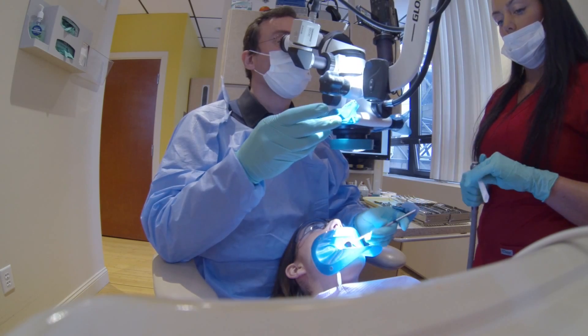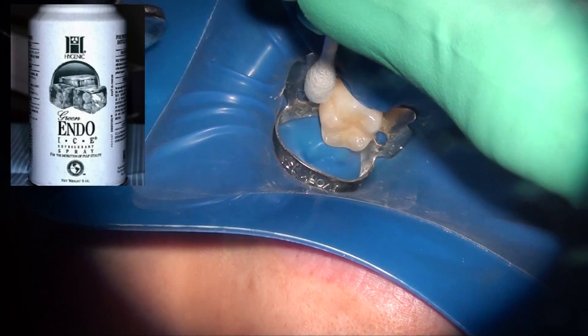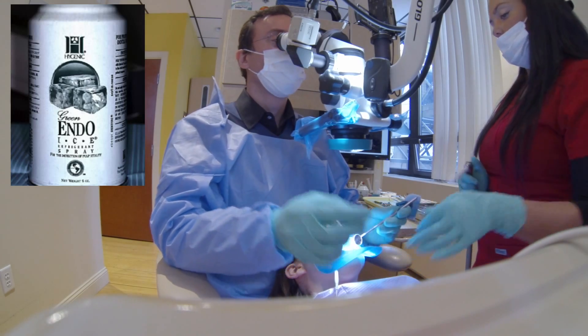You always have to make sure that you're working on the right tooth. After doing that, we do an endo ice test before we get started. The purpose of the endo ice test is to confirm our anesthesia — we expect that the patient is not feeling anything.